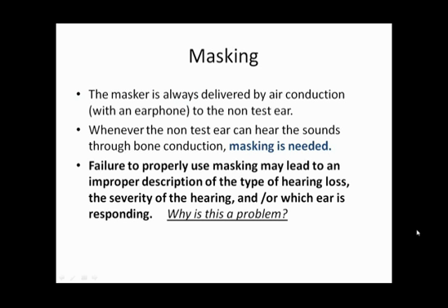via bone conduction. The masker is always delivered by air conduction with an earphone to the non-test ear. Masking may be delivered with a supraaural earphone or an insert phone or a circumaural earphone. Whenever the non-test ear can hear the sounds through bone conduction, masking is needed.